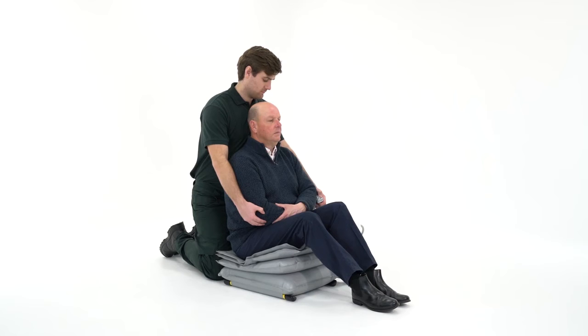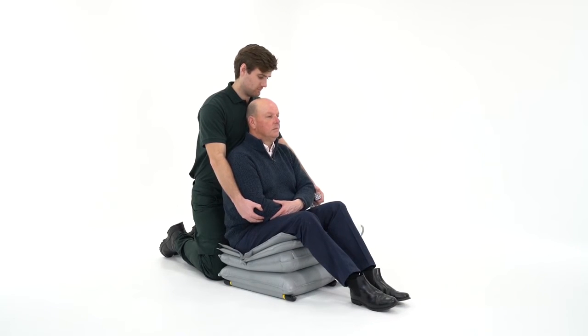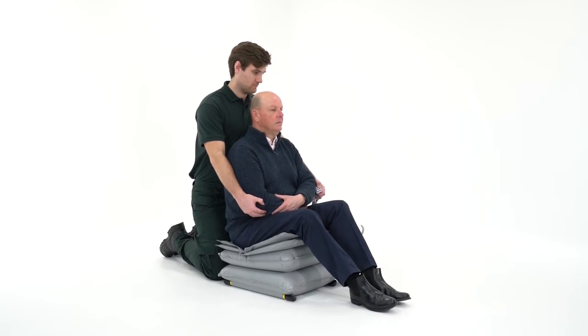Press and hold button 2 to inflate the second section. At the earliest opportunity, the person should be encouraged to bend their knees and bring their feet towards the cushion.